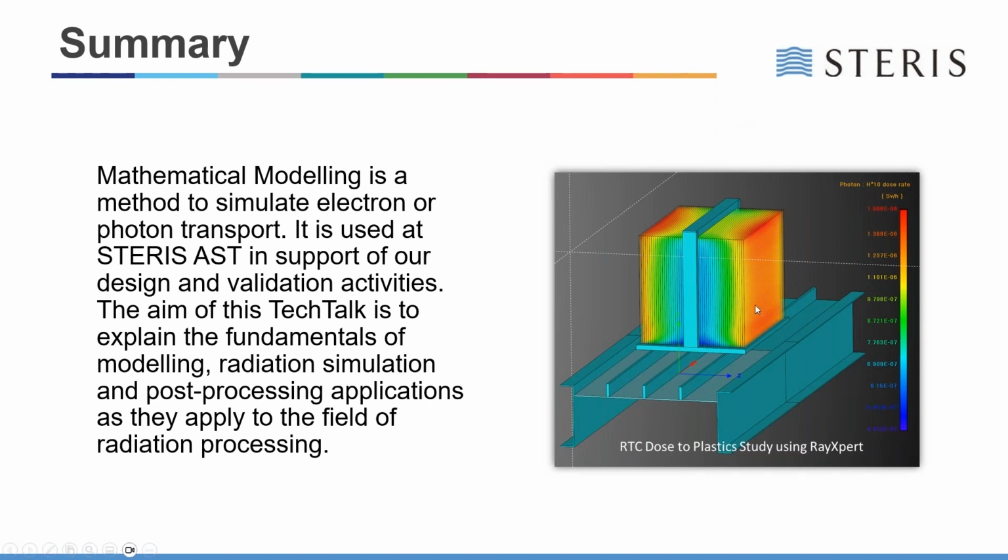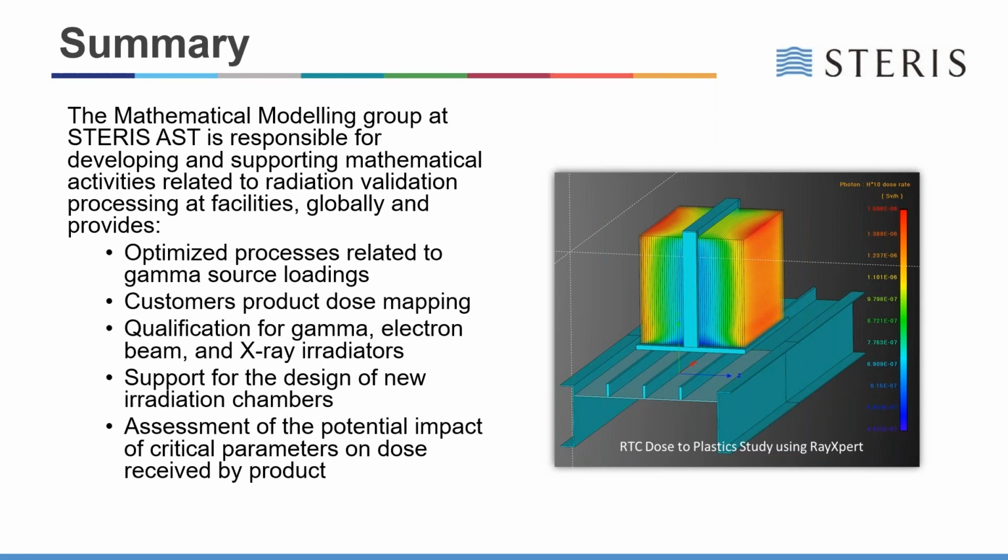What we can see here on the right-hand side is an image that shows an example output from a radiation simulation model. Here we have the title being the RTC dose to plastic study using RayExpert, where RTC is the Radiation Technology Center at STERIS. And we'll get into a little bit more of this further on.